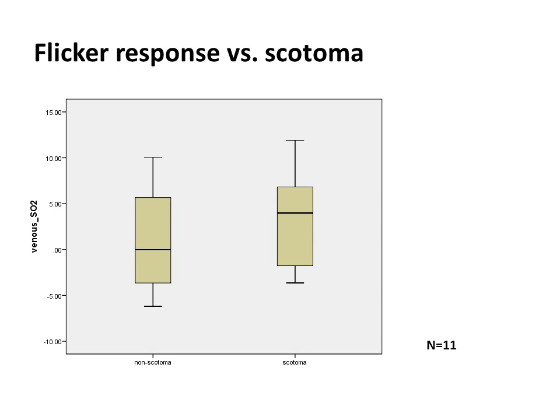Furthermore, in order to test that in detail, we have a study underway. This is data from an ongoing study where we compare the oxygen saturation of the vessels supplying a scotoma area with the vessels supplying a non-scotoma area. That means here we included only subjects with a localized visual field defect.